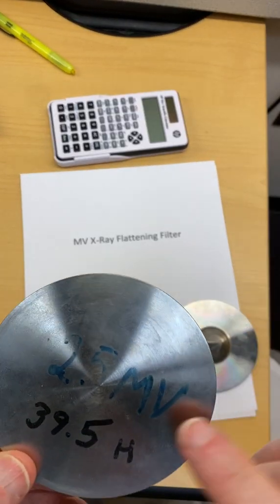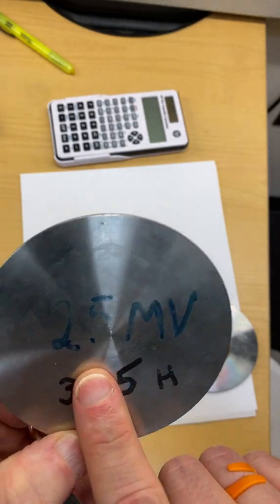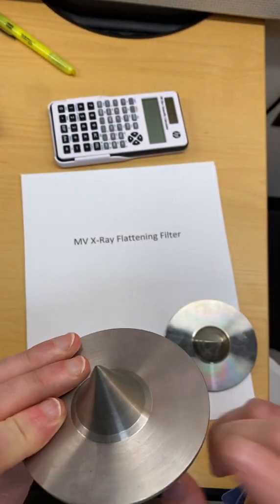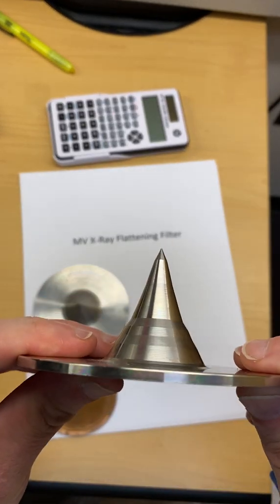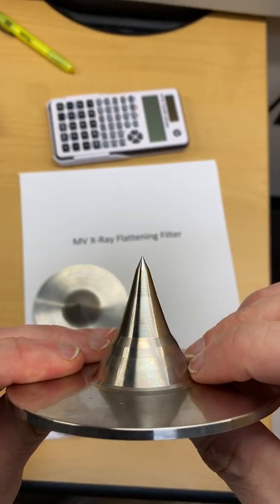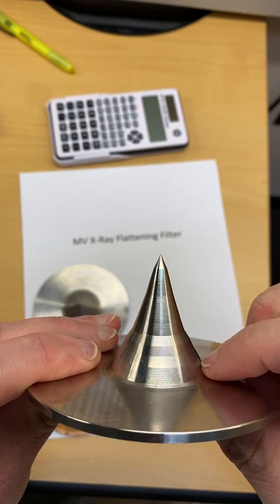These two are slightly different. This one says 2.5 MV on it. I think this came out of an old Linac. I think this one came out of a newer one. And you can see they're specifically designed. They have a very special shape on them.